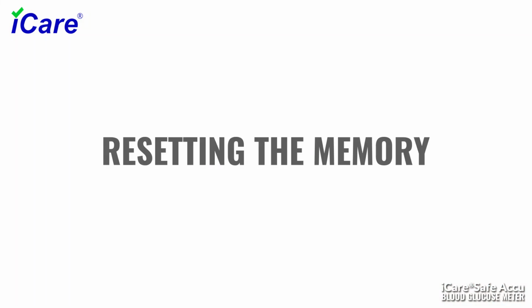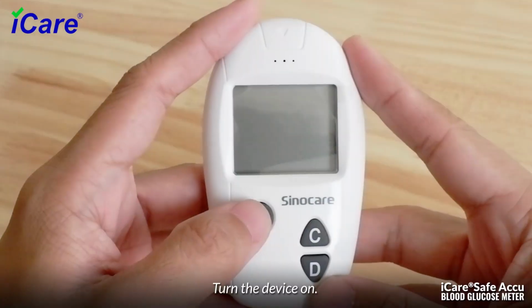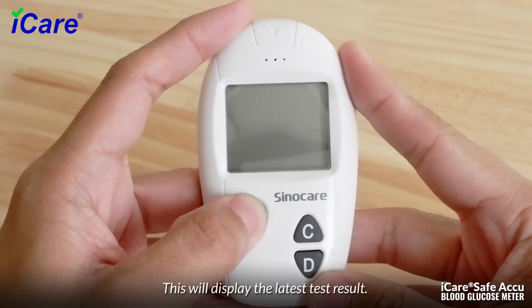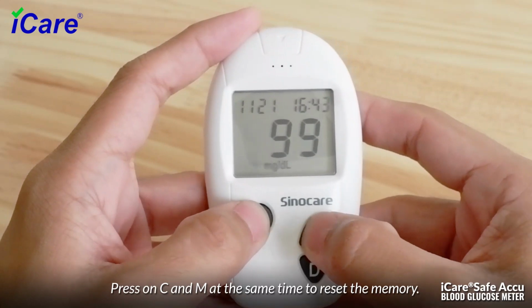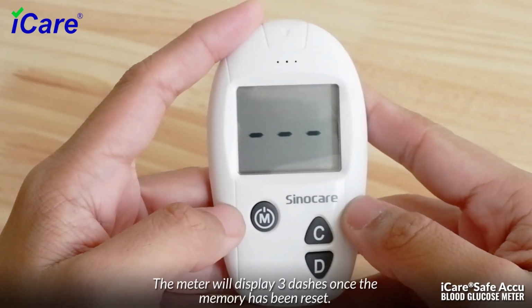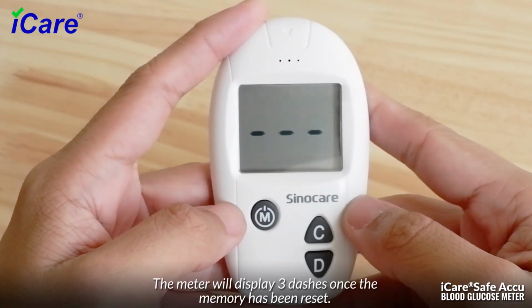Resetting the memory. Turn the device on. This will display the latest test result. Press C and M at the same time to reset the memory. The meter will display 3 dashes once the memory has been reset.